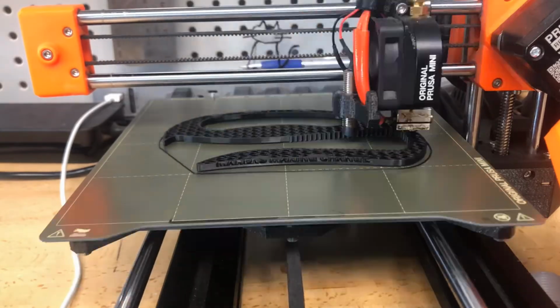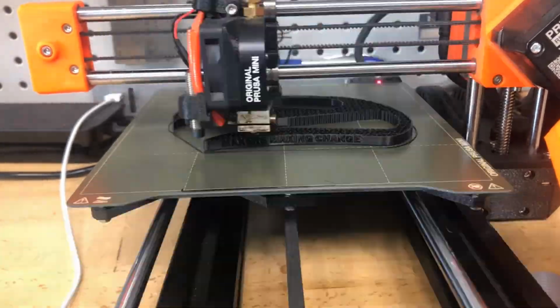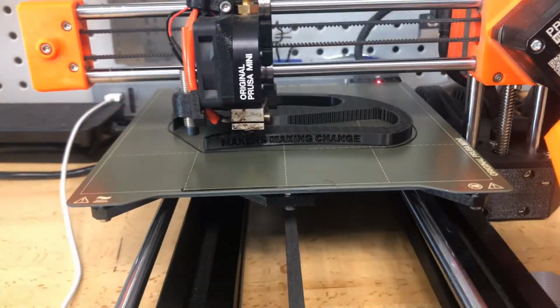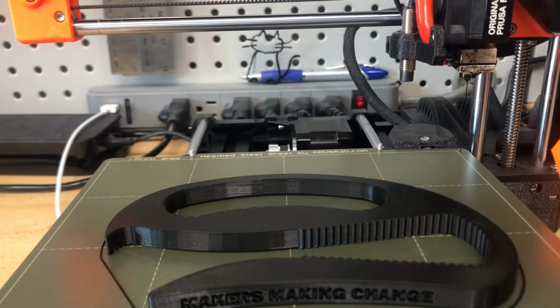Pulling the file off, let's give it a quick test. I've tested this particular file for opening soda bottles. I actually had a little bottle of glue that had gotten stuck. I was able to open it up and close it down, so just depending on the use case, a lot of the assistive technology that you make can have multiple uses.